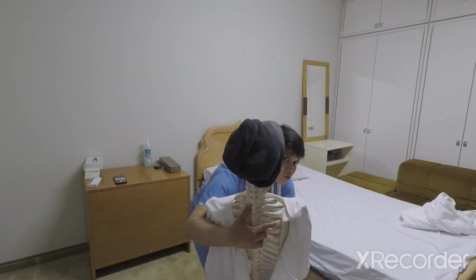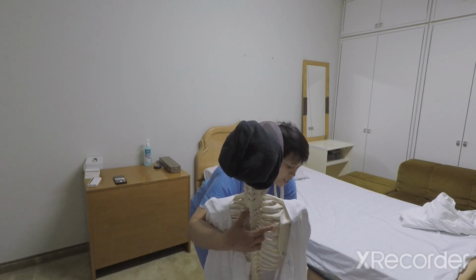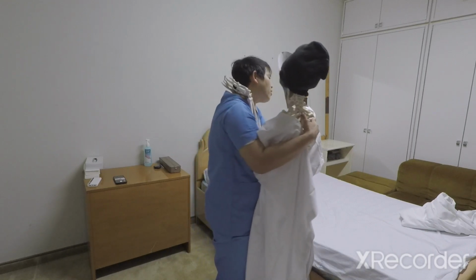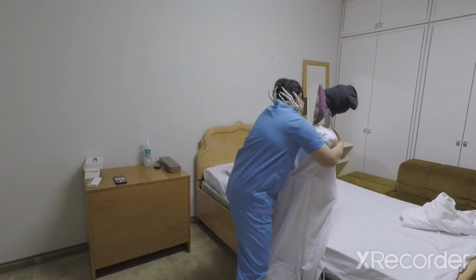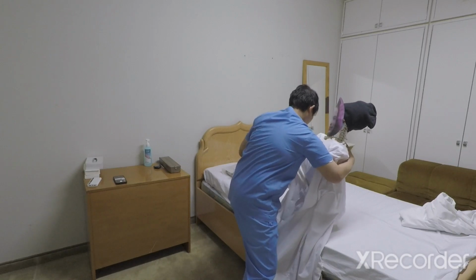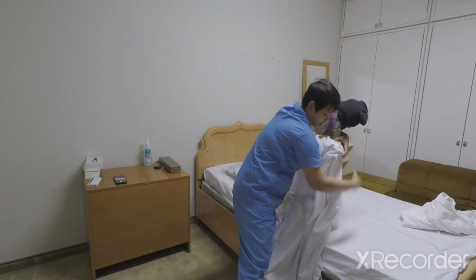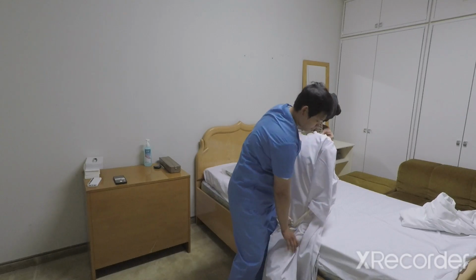Ask her to lift, 1, 2, 3, and be careful. If there's a contact precaution, you should wear your PPE. Then up and down. PPE protects us against infection and also avoids cross-contamination for the patient.